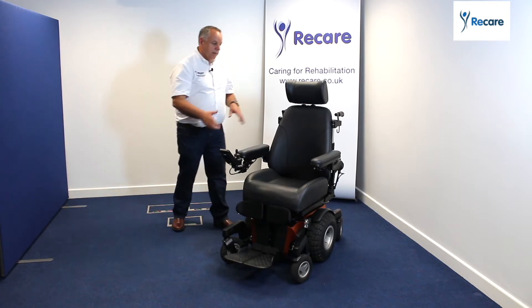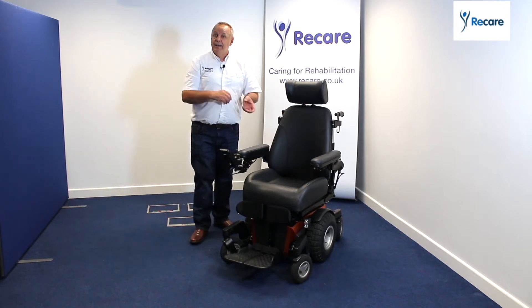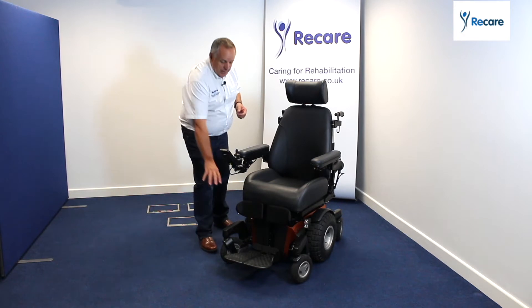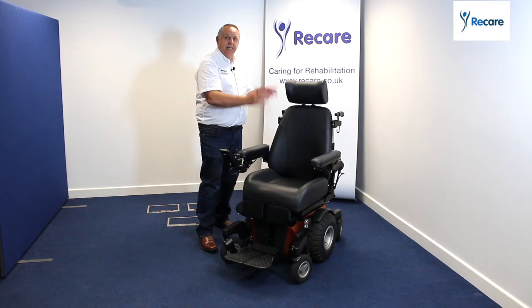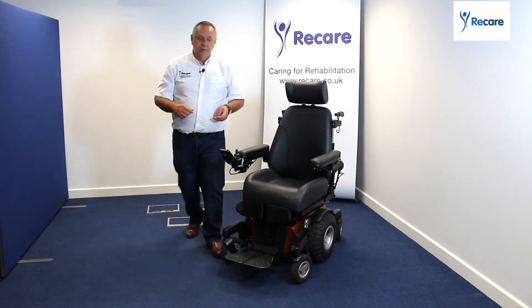You can also have lots of different seating systems — this is the basic seating system, but you can have high clinical seating systems as well. So what the whole product gives you is that full solution: it gives you that platform base which is your off-roader, it gives you that tilt-in-space function for your clinical side of things, and it also gives you the seating that you need. So what I'm going to do now is just show you a few functions.